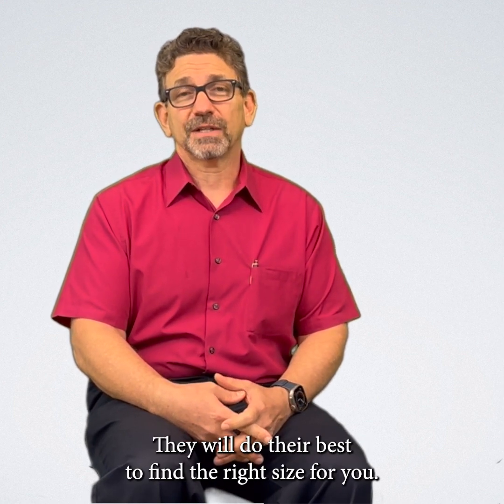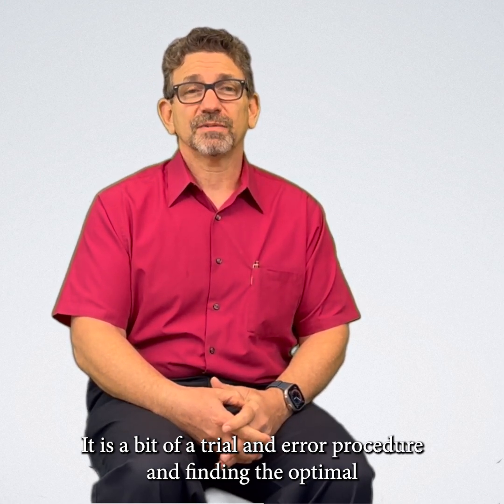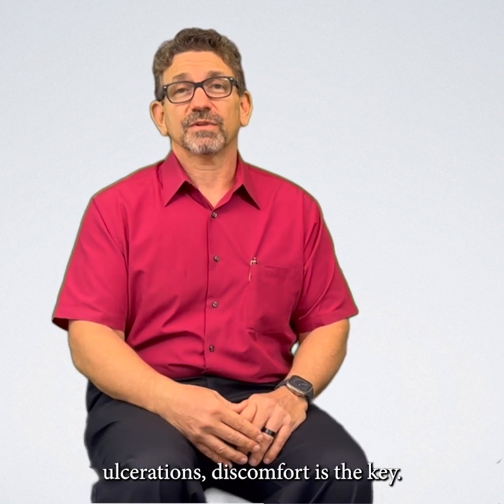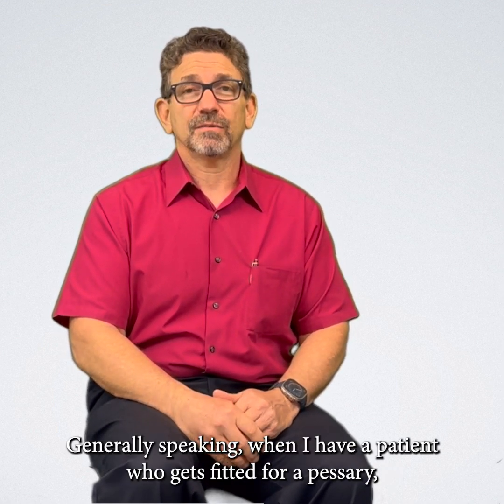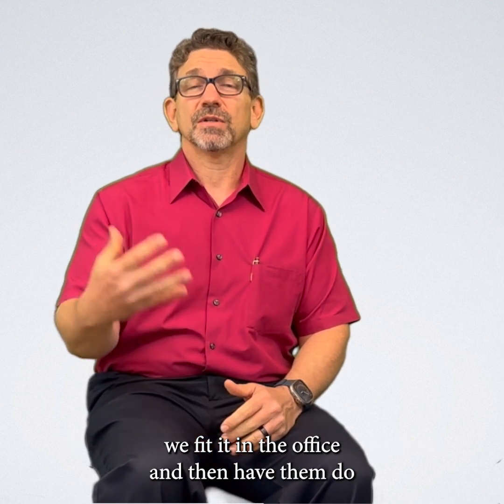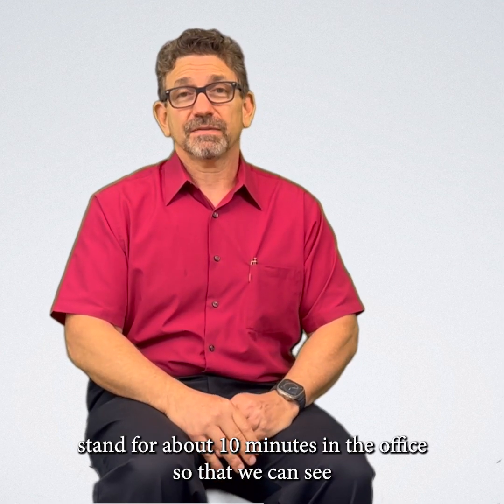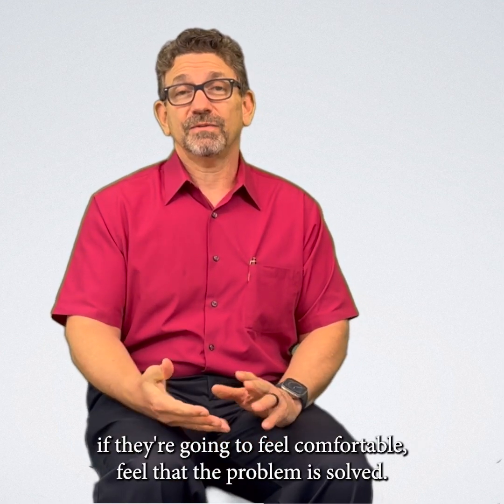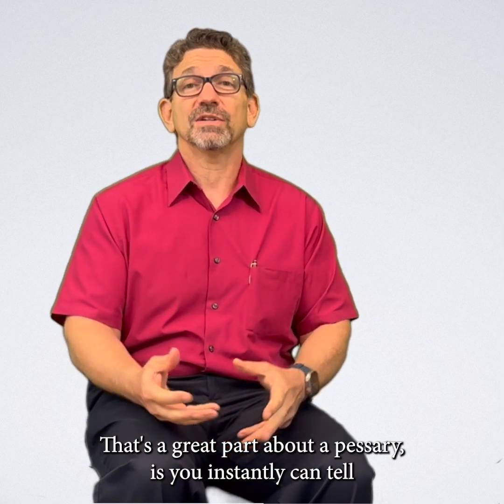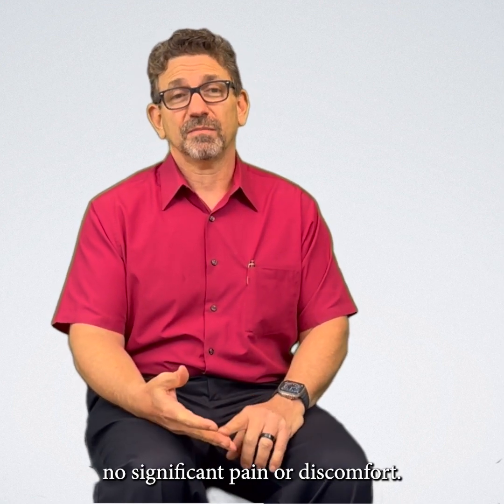They will do their best to find the right size for you. It is a bit of a trial and error procedure, and finding the optimal that is not so small that it easily falls out and not too large that it causes pressure, ulcerations, discomfort is the key. Generally speaking, when I have a patient who gets fitted for a pessary, we fit it in the office and then have them do normal activities of home, walk around, lift, tie their shoes, sit, stand for about 10 minutes in the office, so that we can see if they're going to feel comfortable, feel that the problem is solved. That's a great part about a pessary, is you instantly can tell that it holds things up and it eliminates that pressure, and also ensure that there's no significant pain or discomfort.